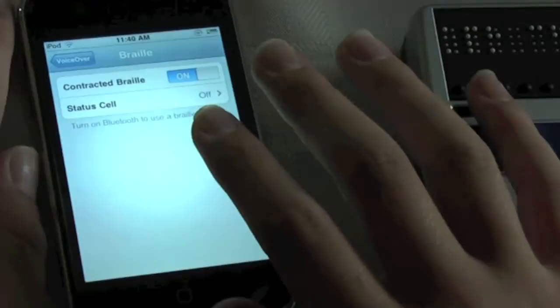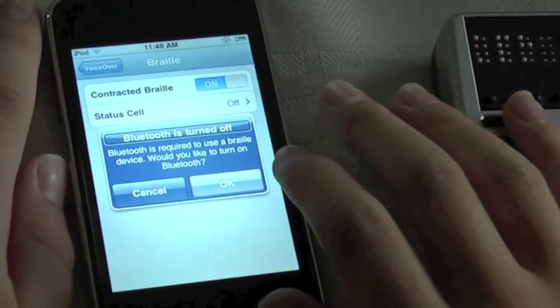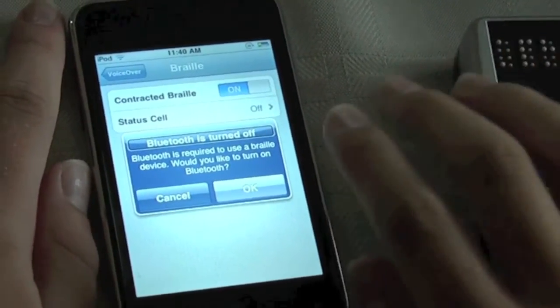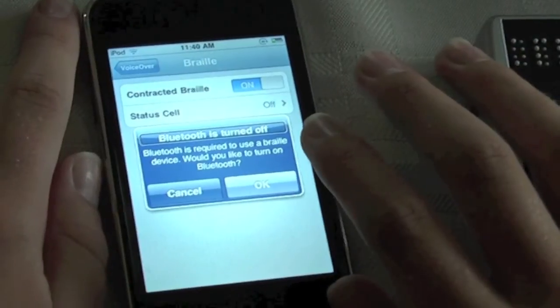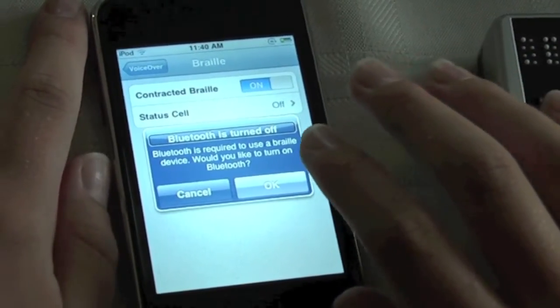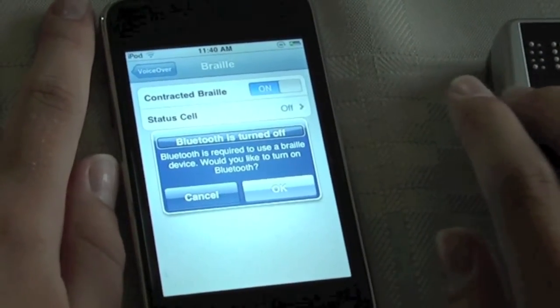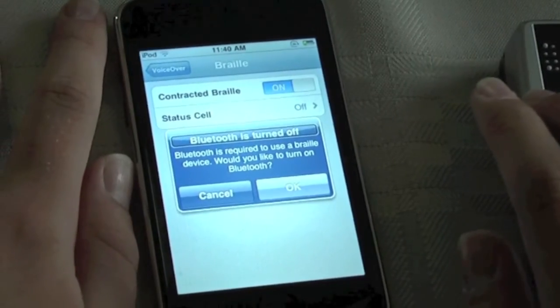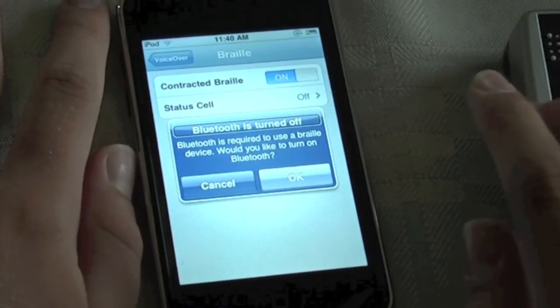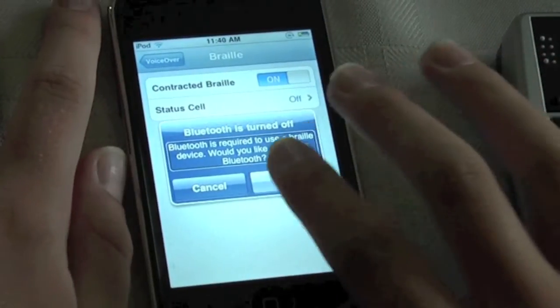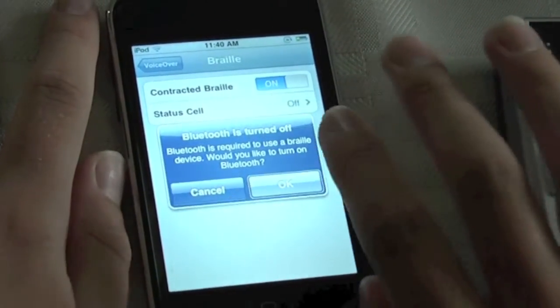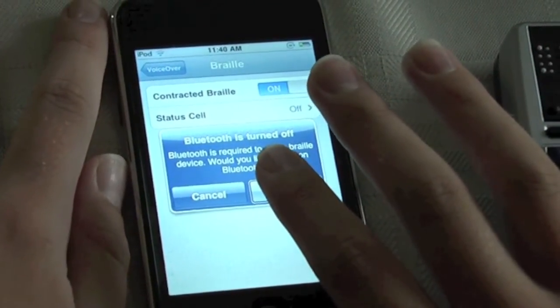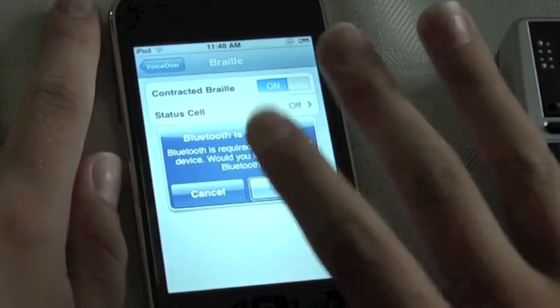An alert says Bluetooth is turned off. Bluetooth is required to use a Braille device. Would you like to turn on Bluetooth? You don't need to enable Bluetooth before you get into the Braille settings as it informs me that Bluetooth is turned off. I'll double tap OK which will open the Braille settings and turn on Bluetooth.